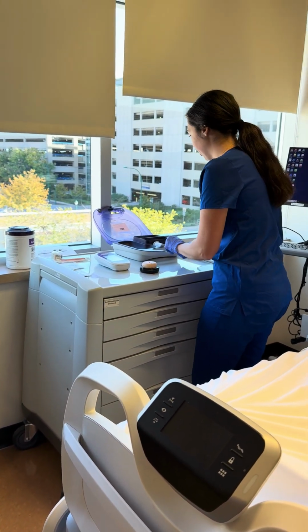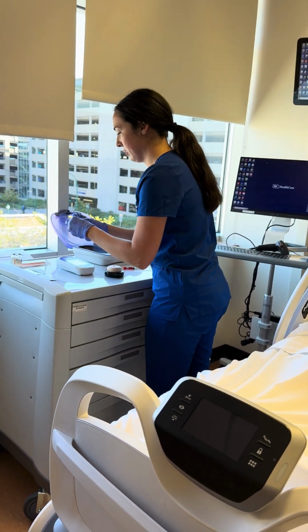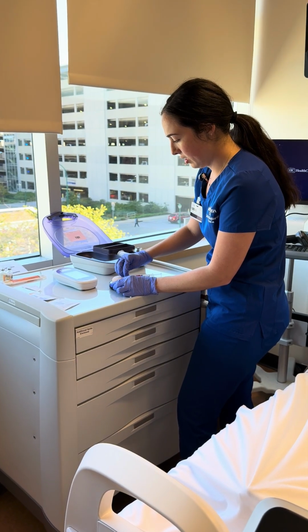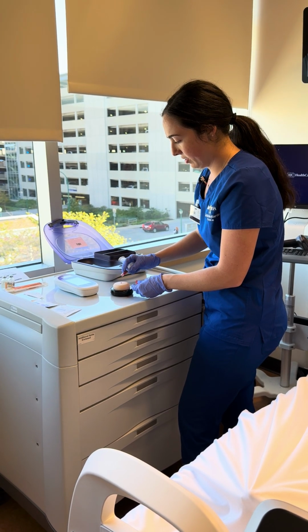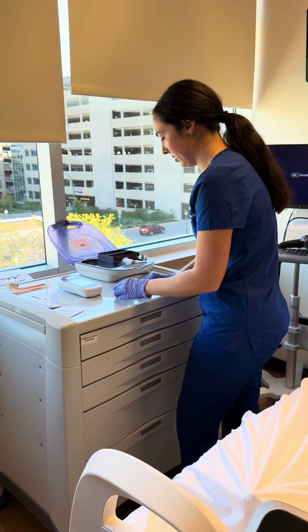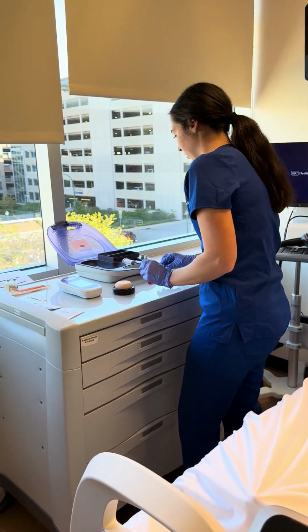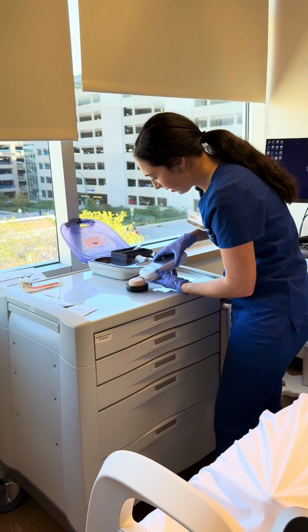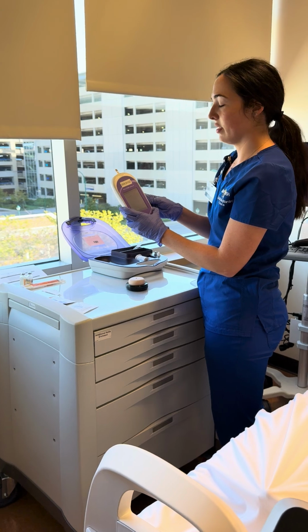All right, so the first drop of blood, I'm going to take a piece of gauze and wipe away the first bit of blood so that we're not using that. We want the second drop of blood. All right, there it is. Wipe away the excess. Okay. And I'm going to use my AccuCheck here, and it's going to read the level.